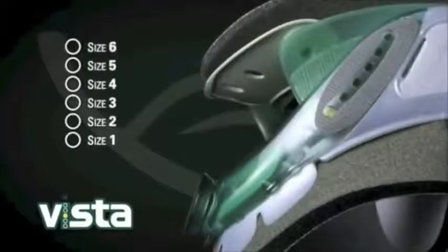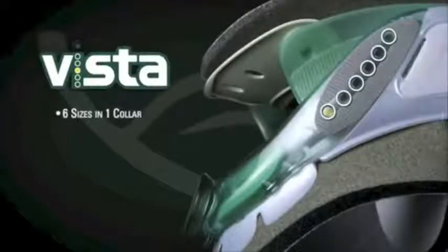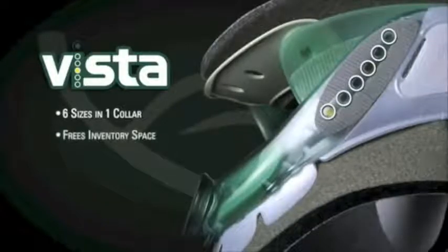By incorporating six sizes into one collar, the Vista eliminates the cost of storing multiple sizes, freeing up valuable inventory space and eliminating SKUs.